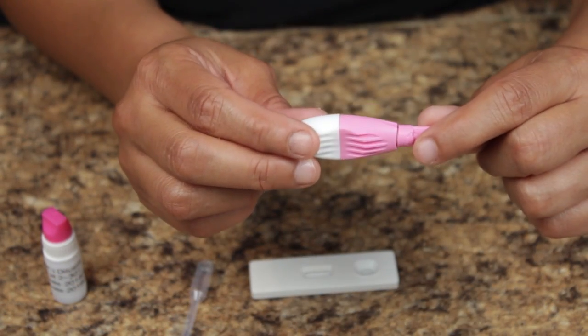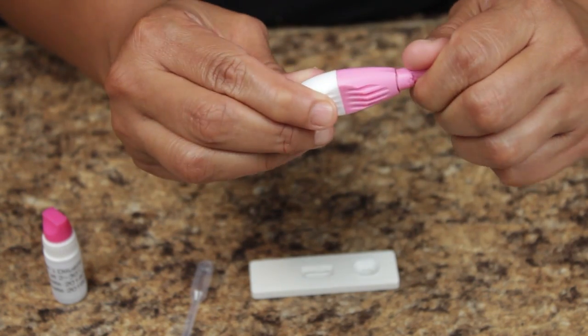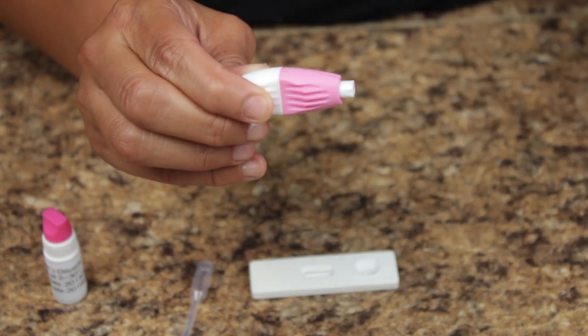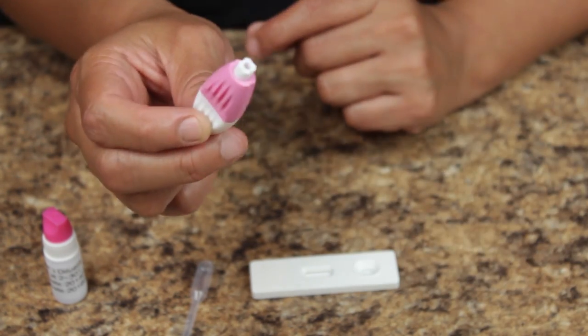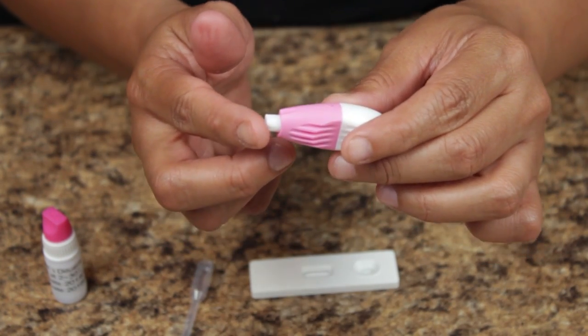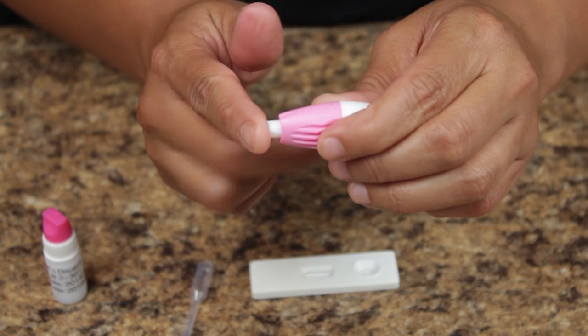Next, prepare the lancet by turning the key twice and pulling to remove — one, two. The lancet is now ready for use. Press the opened end of the lancet firmly against the sterile area of your finger and press the side button to release the needle.